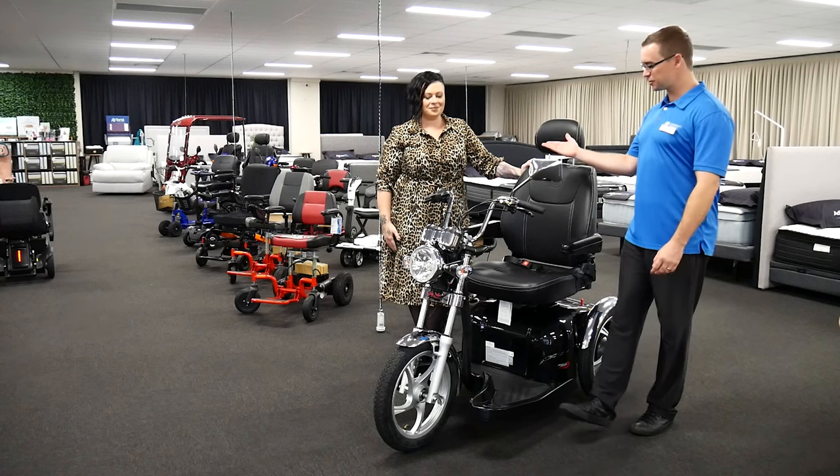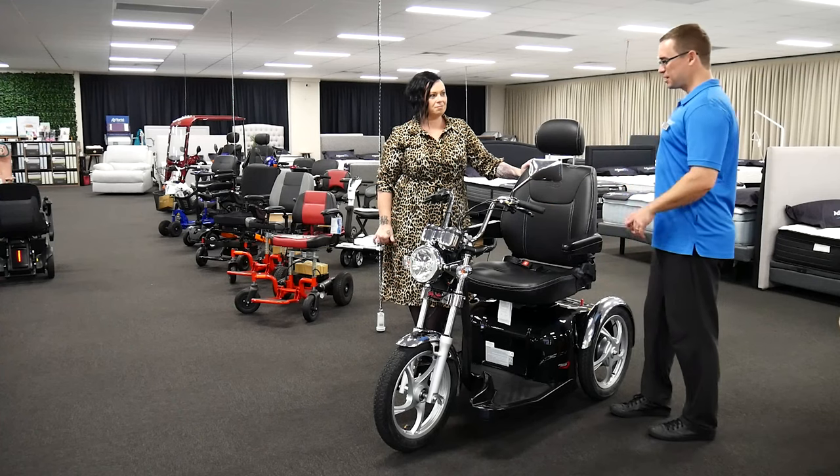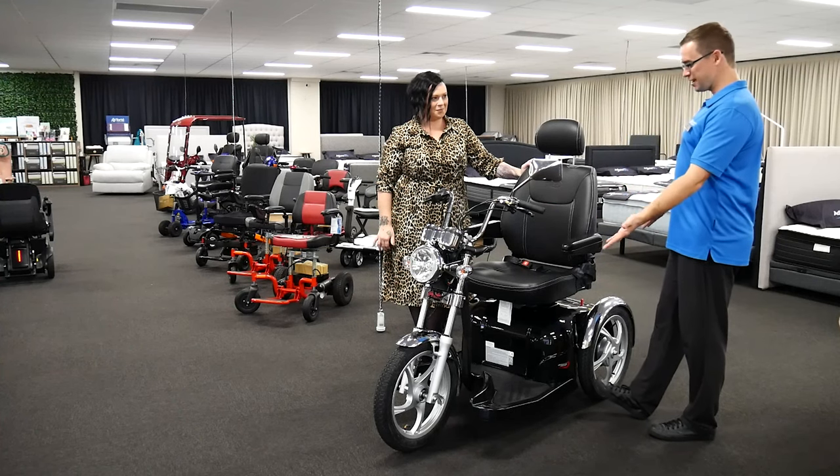We're here at Adjusted Care with Trish, looking at a range of equipment. We've got this beautiful piece of equipment here in front of us. What have we here?